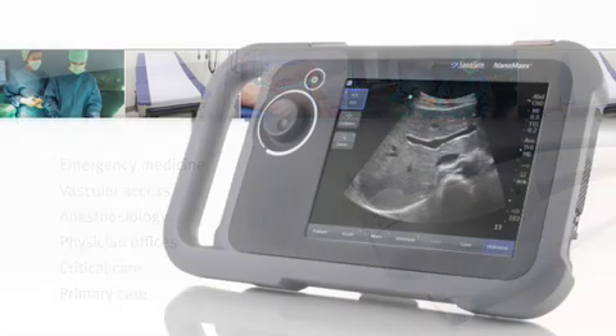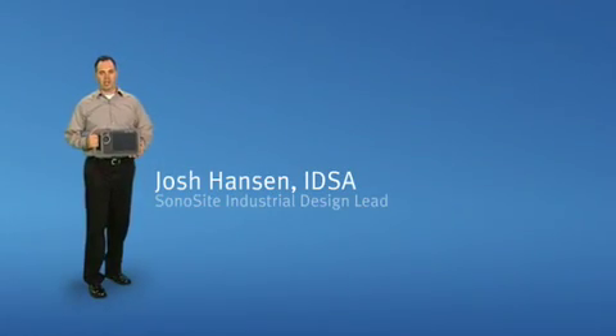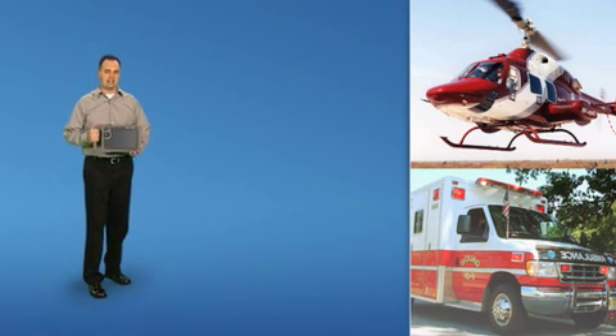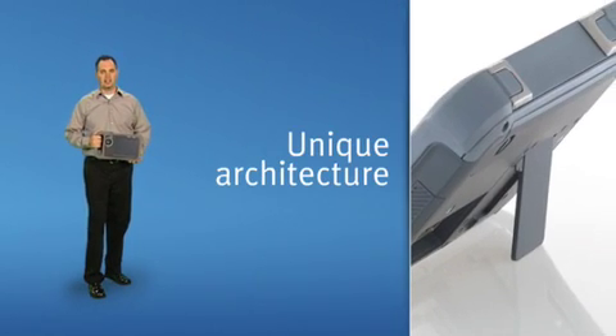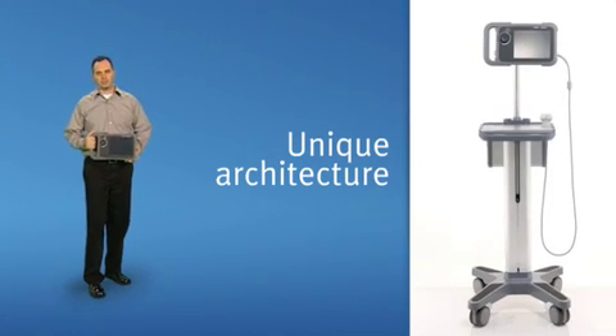We put the same high standards that the entire Sonocyte family of products is known for into NanoMax. It is rugged enough to perform in a range of extreme environments. You can see it is easy to carry, but we wanted it to be as flexible as possible, so we have a kickstand and a VESA mount to use, as well as a wall mount or a traditional floor stand.